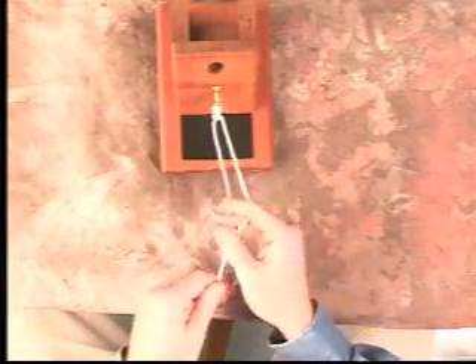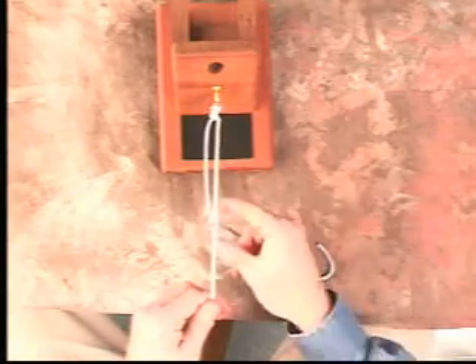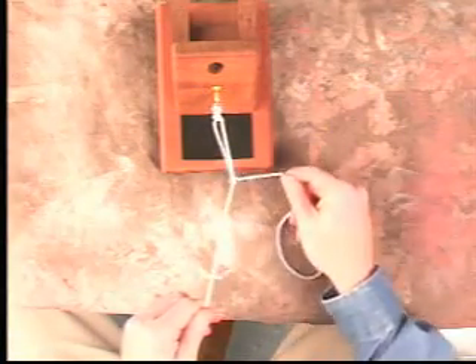Alternating posts, an underhand throw is placed on the new post limb and slid into the joint.